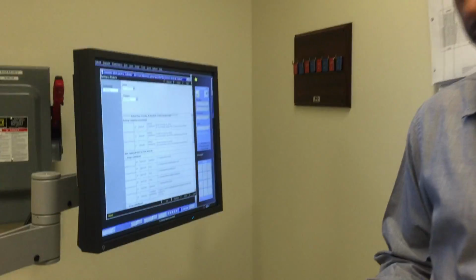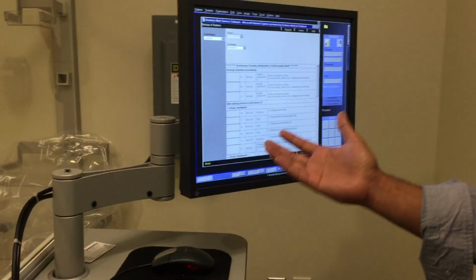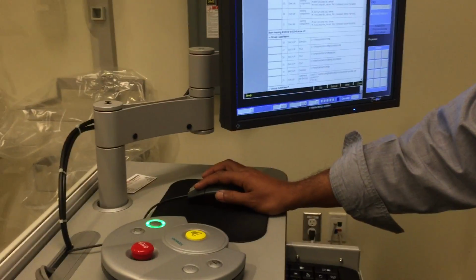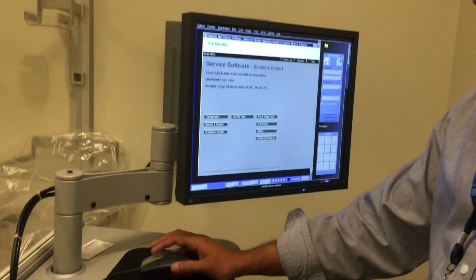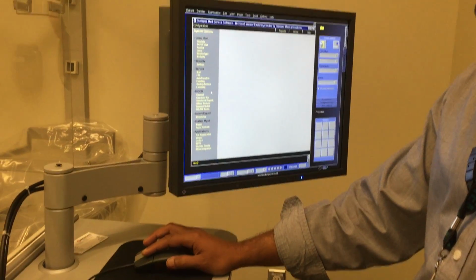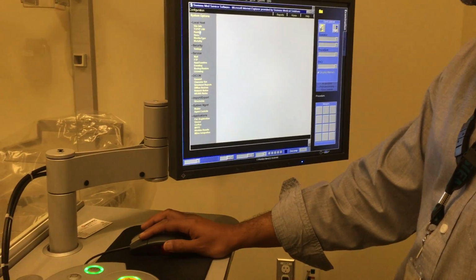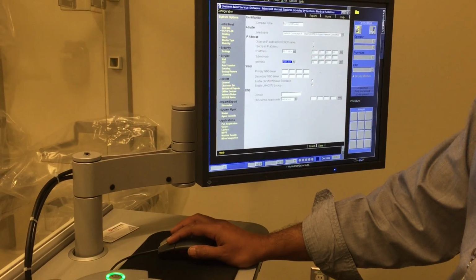Right. How do you set up the automatic DICOM send? Is it already set up, or can you change it now? I'm right now on the service page. Basically, we have to go to our Siemens service screen. I have done pretty much the backup. So here, this is our Siemens service home page. You can see this, and then here we go to the config. And then there, we check the options, whether all the DICOM options are enabled. We make sure, and then from there we set up the host information, and then enter all these networking settings for the host.